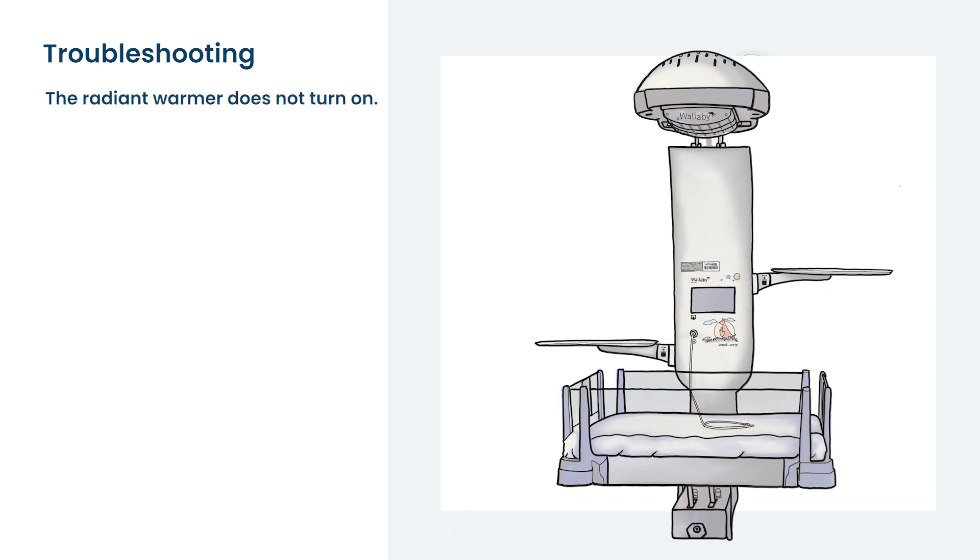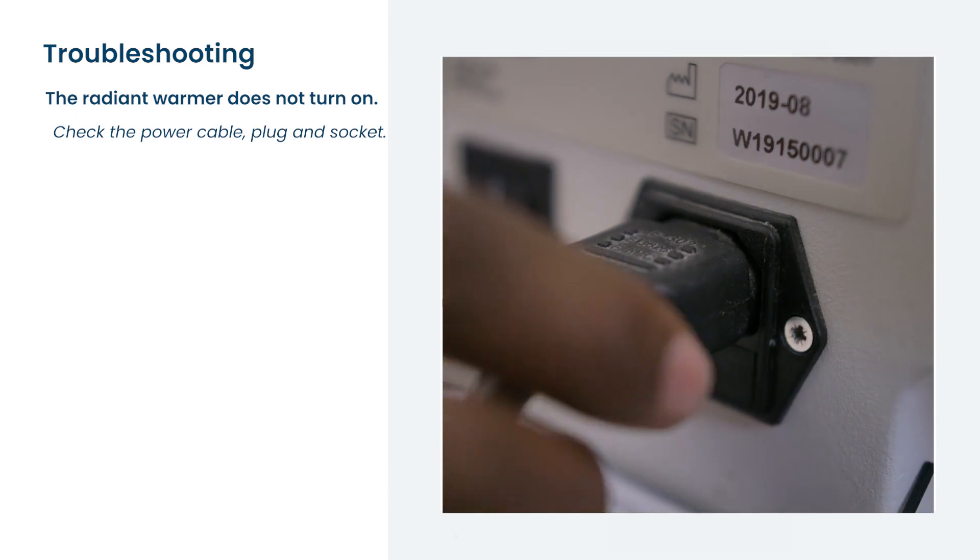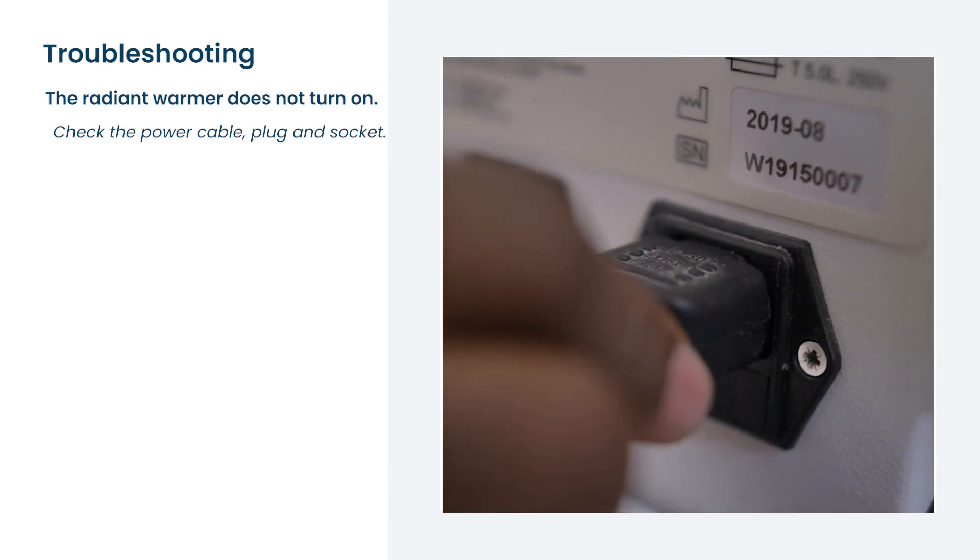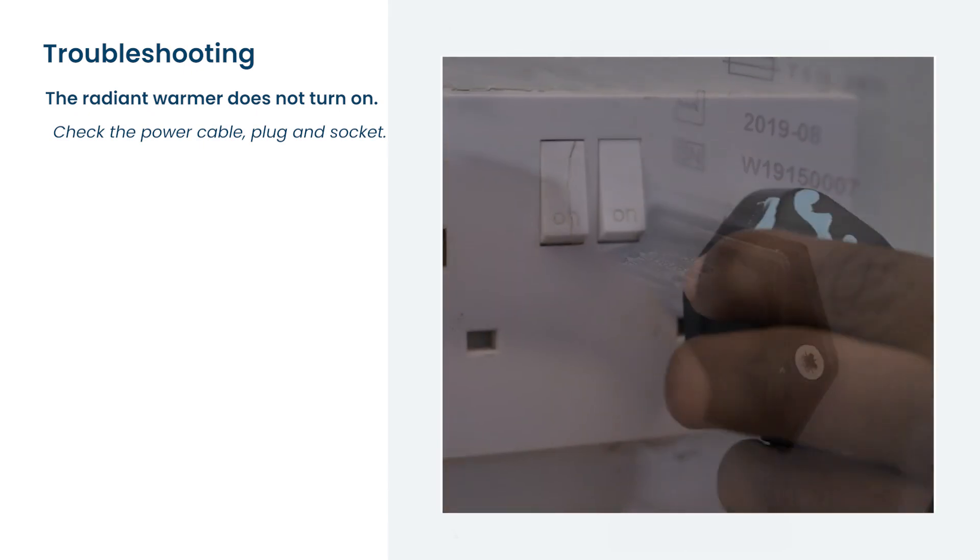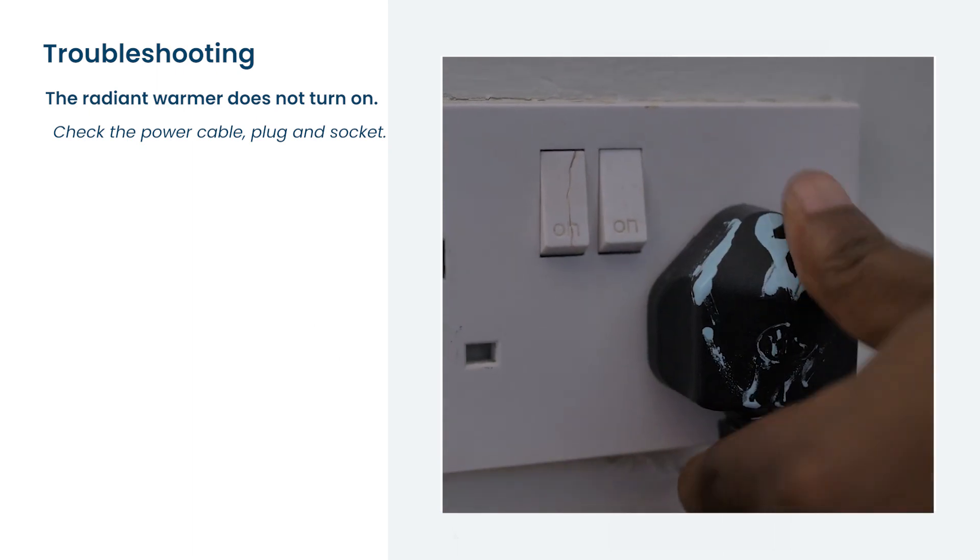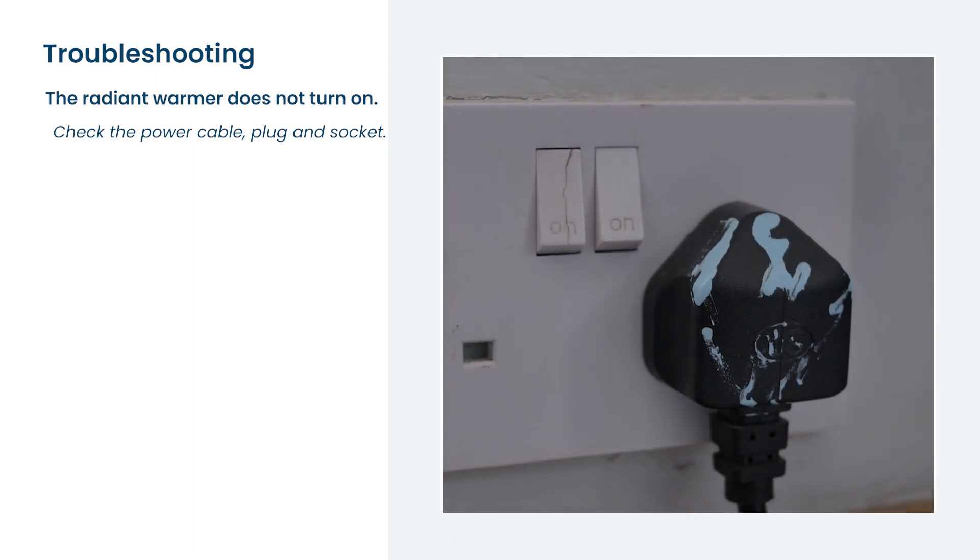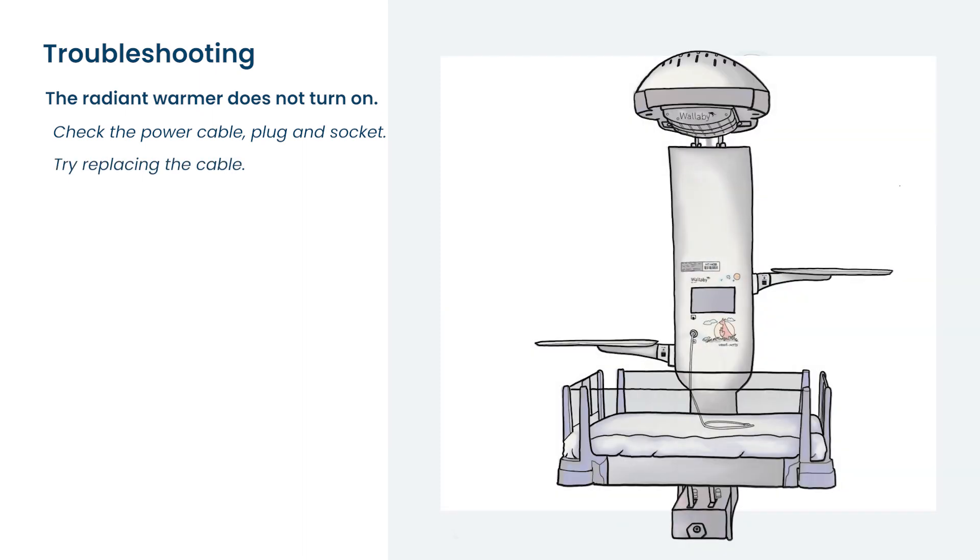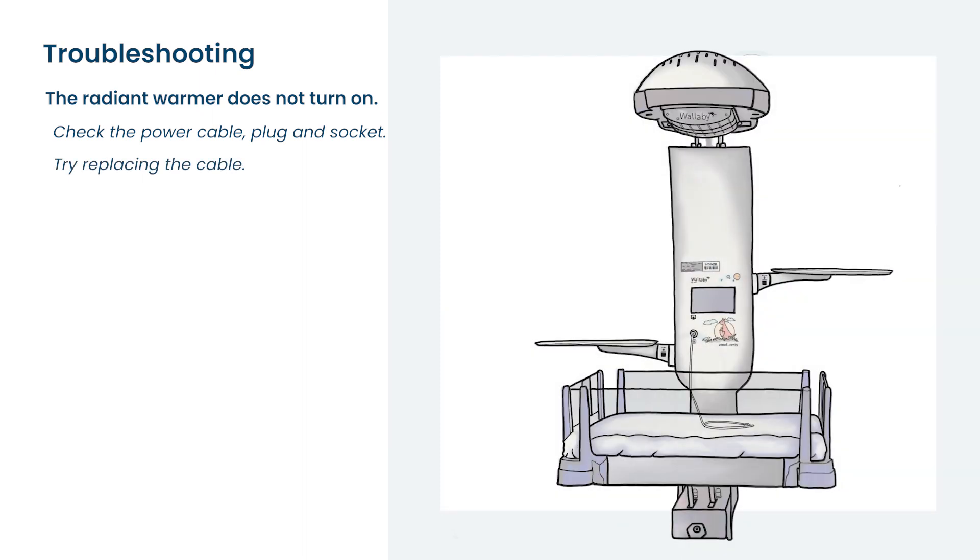If the radiant warmer does not turn on, check that the power cable is plugged properly into the back of the machine and the wall and that the socket has power. If that does not resolve the problem, try replacing the cable. If that does not work, contact the maintenance department.